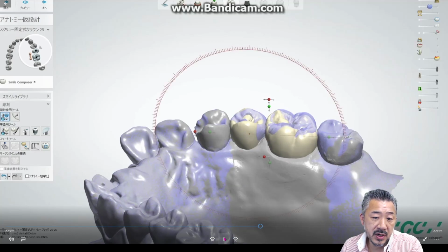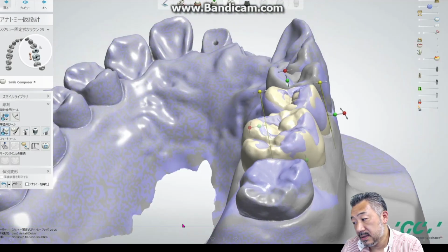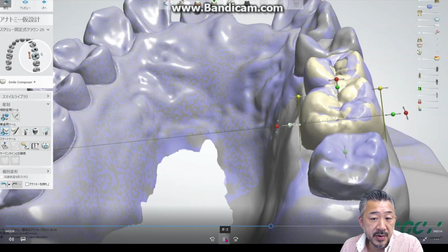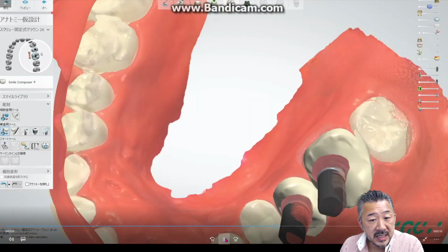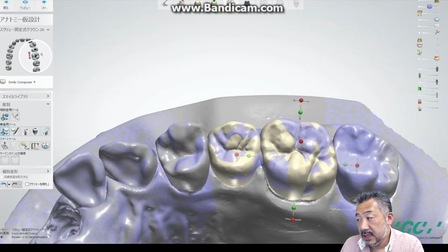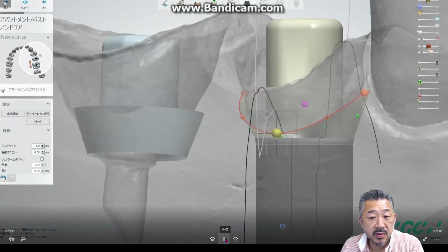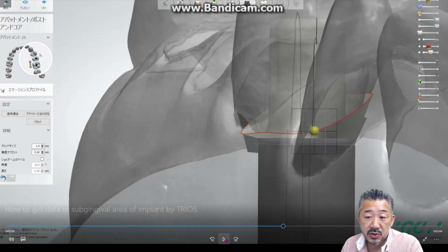The default displayed tooth is similar to the provisional outline. So the shape of the provisional is shown transparent in purple. Move the teeth with overall deformation and change the sides with individual deformation.